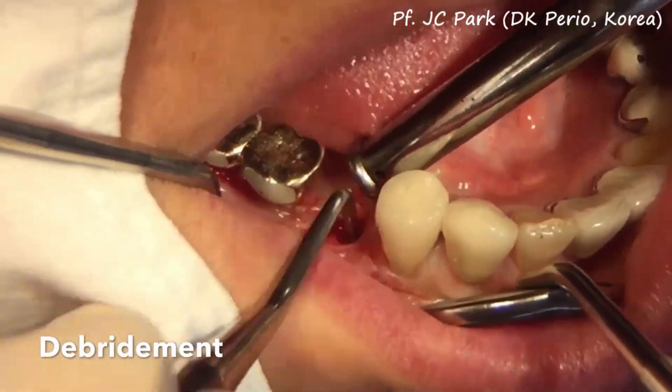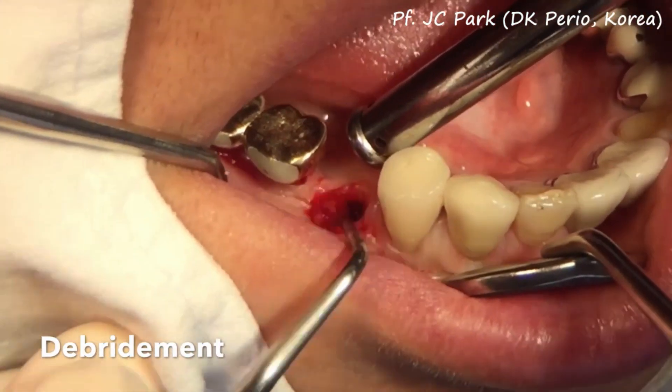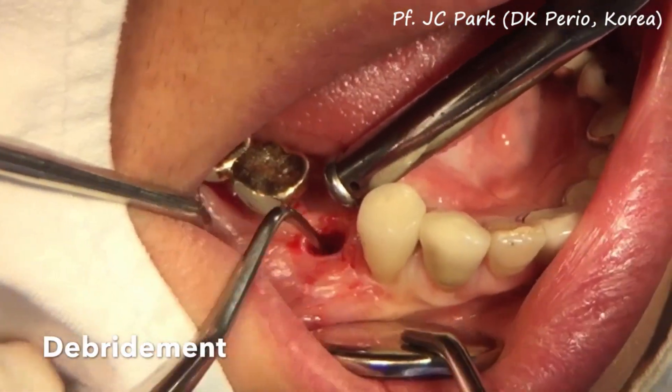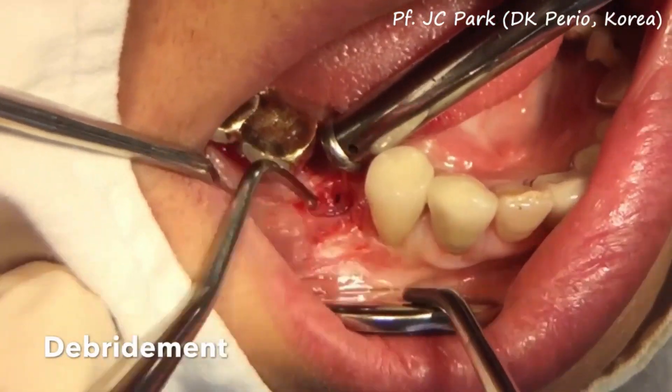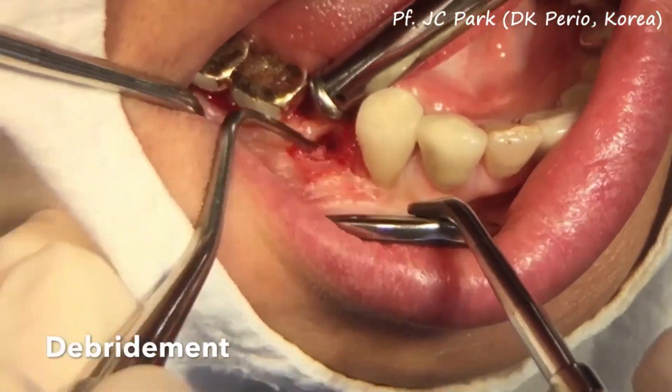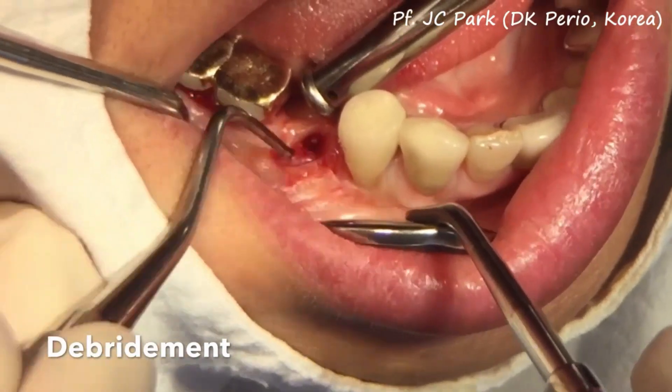Please note that the keratinized tissue is completely gone on the buccal side of the implant. The complete removal of the granulation tissue is critical, since the bone graft will be introduced and the presence of granulation tissue will interfere with bone healing.